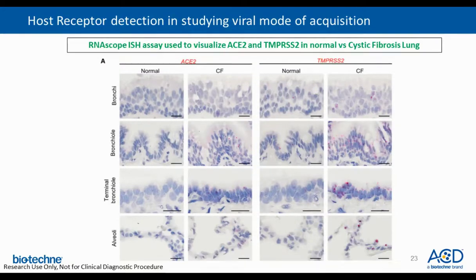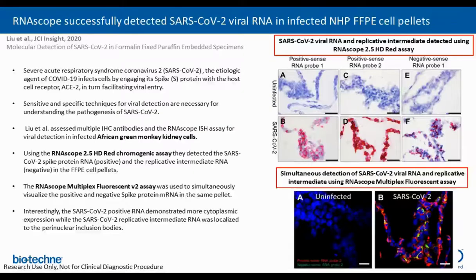To gain insight into pathways that might contribute to the dysregulation of ACE2 expression in cystic fibrosis lungs, they also tested the effects of selected cytokines on ACE2 expression in large airway epithelial cultures. Interleukin-1b, the dominant pro-mucin secretory cytokine in cystic fibrosis and non-cystic fibrosis secretions, upregulated ACE2 but did not upregulate TMPRSS2.